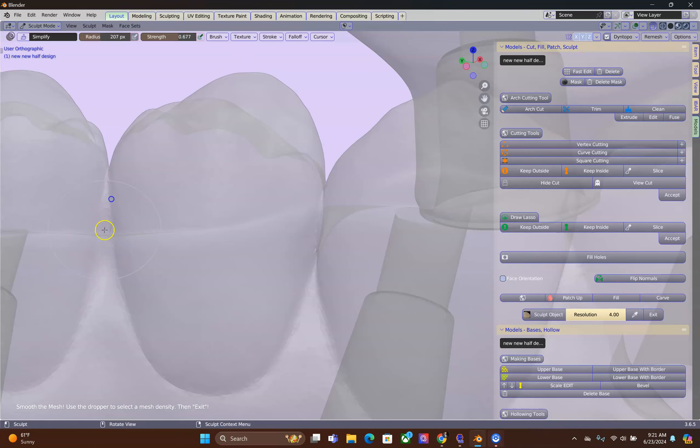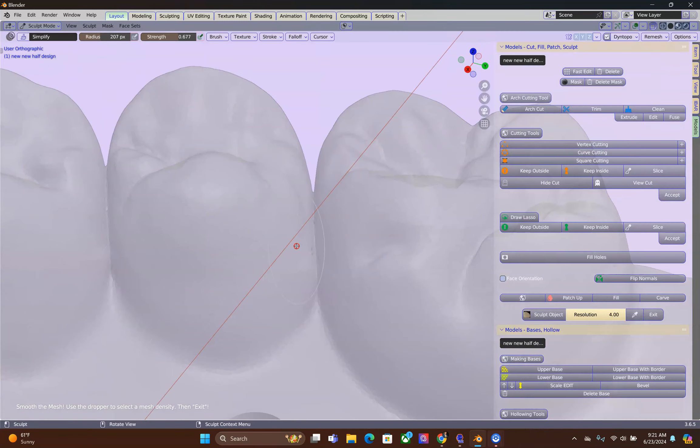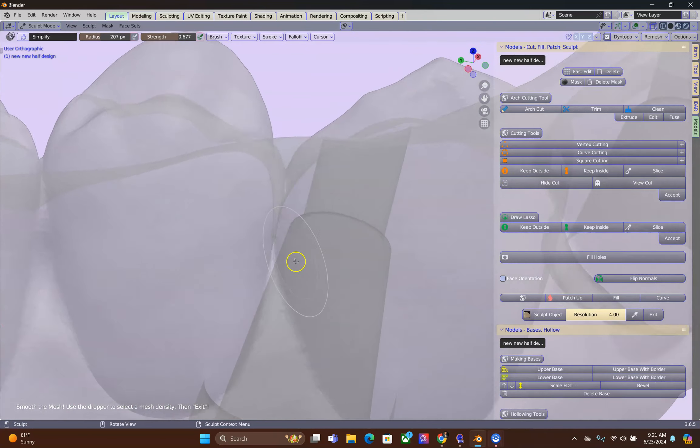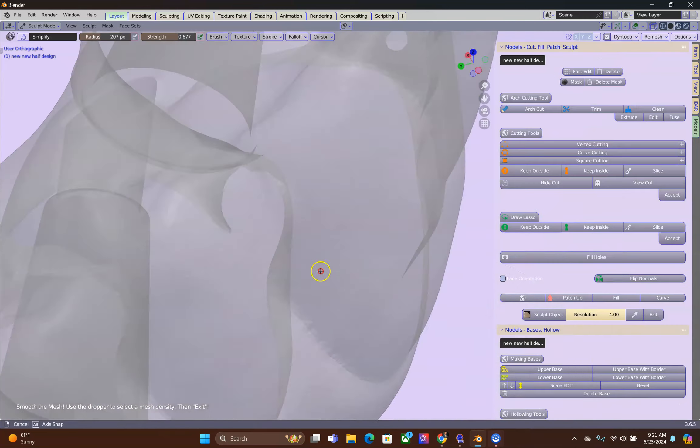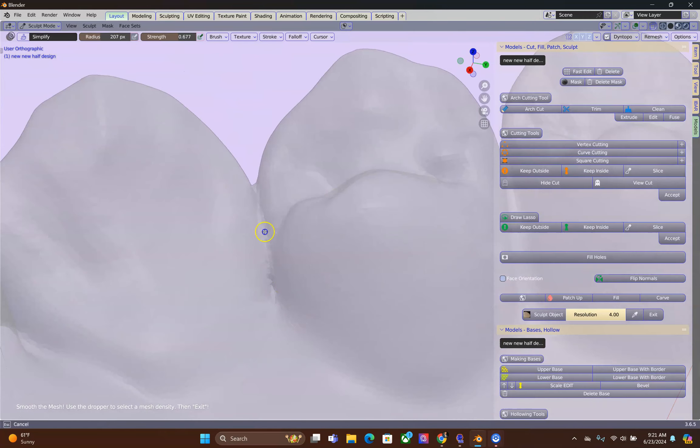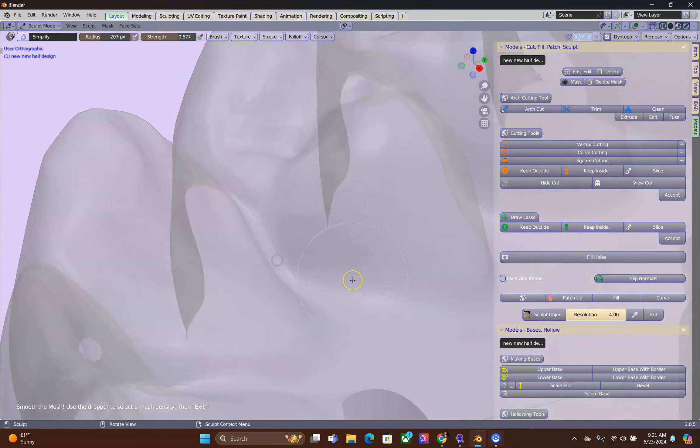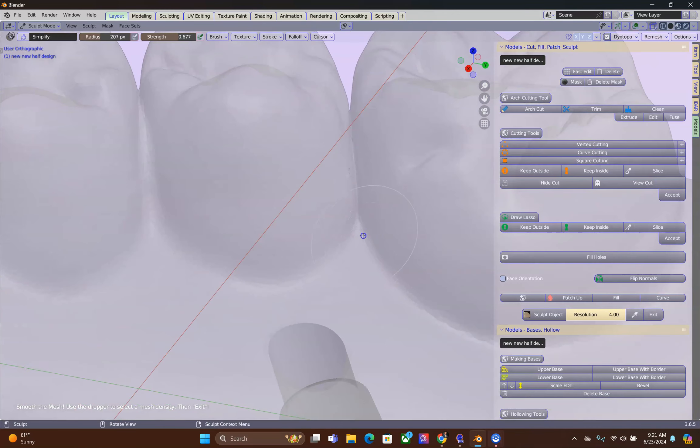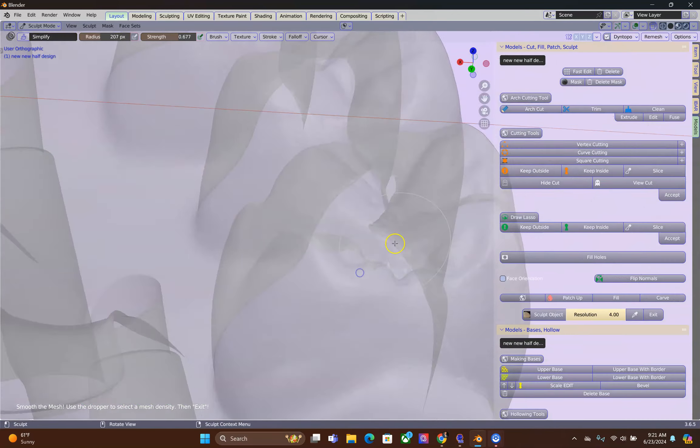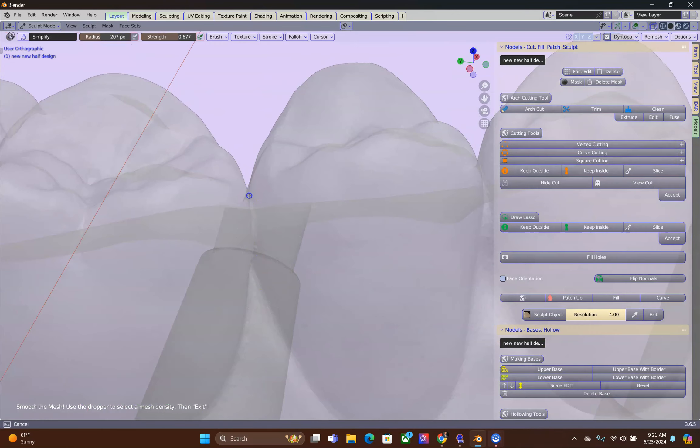So especially this one, I'm going to smooth and as we're smoothing it enlarges the contact area so that we can actually put a bar in between.